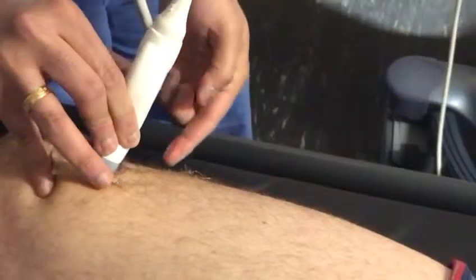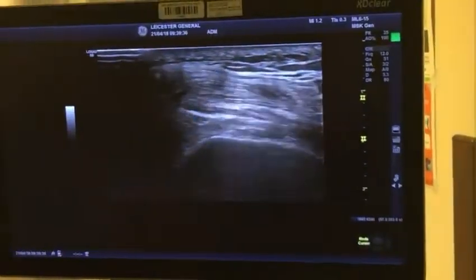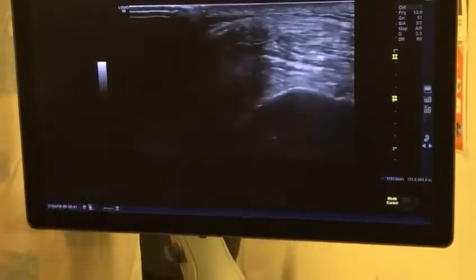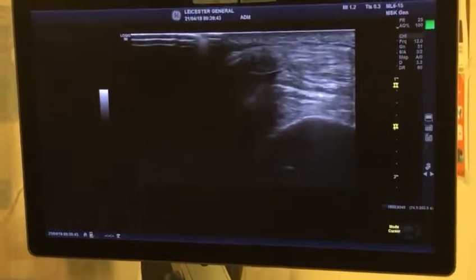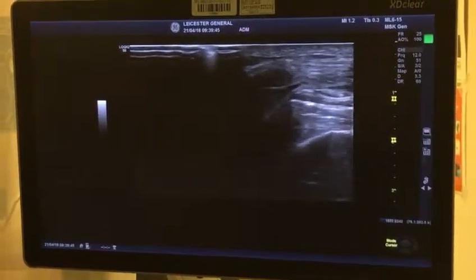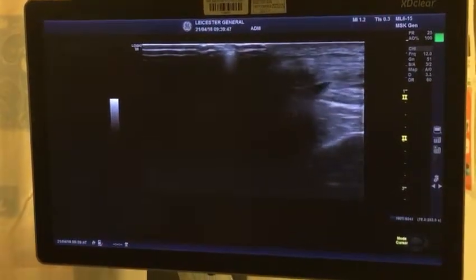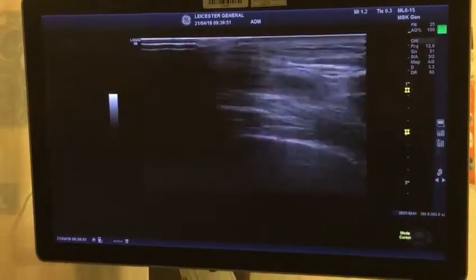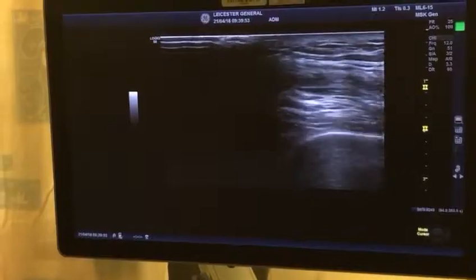You bring the needle lateral to medial — the same as for the popliteal level — and go into that recess. You can still see the fluid. That's where the lateral approach is done. This connects to the joint — the suprapatellar recess is an out-pouching, so you're getting into the joint. That's your knee joint injection.